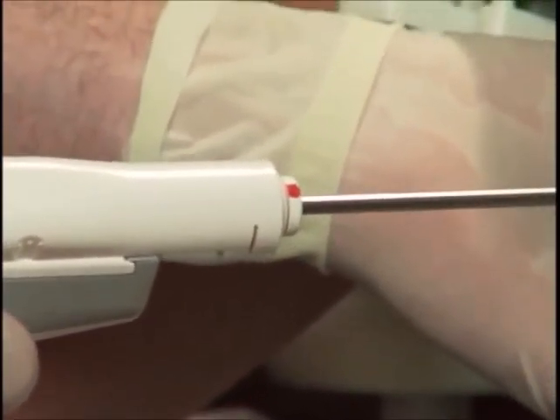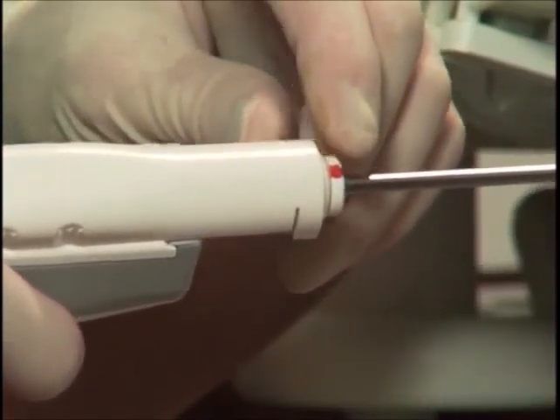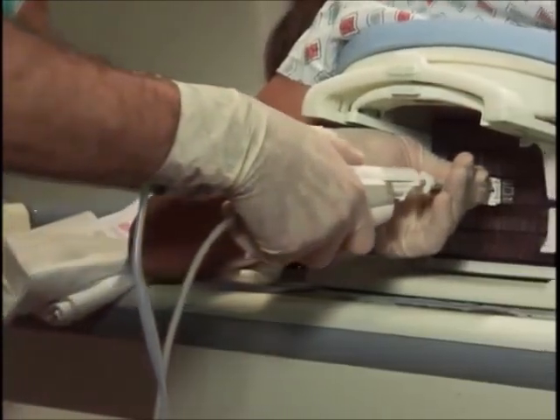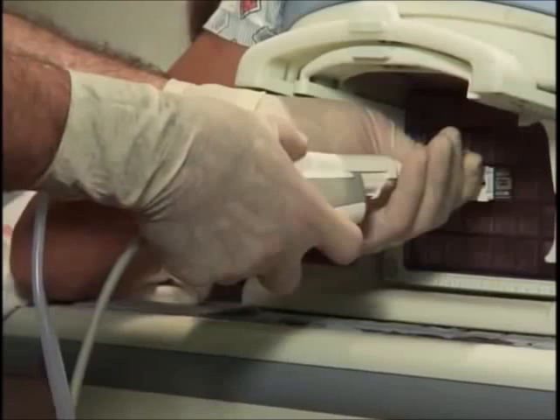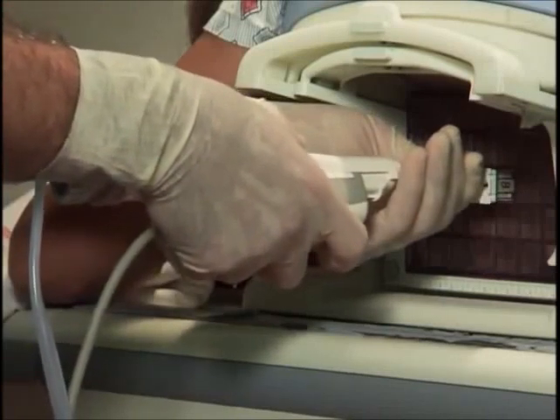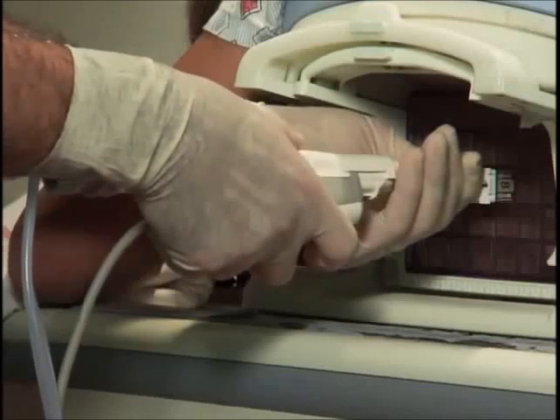Prior to beginning your biopsy, make one last visual check that the aperture for the biopsy is at the expected location. You can see the red indicator that this is at the 12 o'clock position — make sure that's the position you wish to start with. To insert the device, grasp the sheath to prevent any movement, and seat the device all the way against the introducer sheath. You can then activate the biopsy either by depressing a button on the handle device itself or by pressing the foot pedal. Holding down either the button or the foot pedal will activate your fully planned biopsy; hold it until the biopsy is completed and the device will stop.